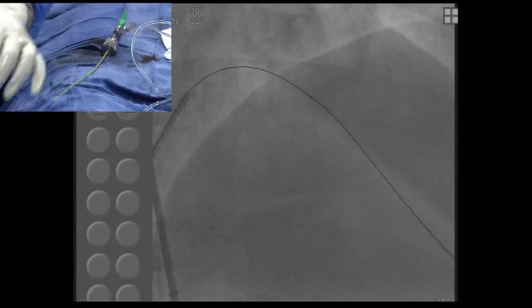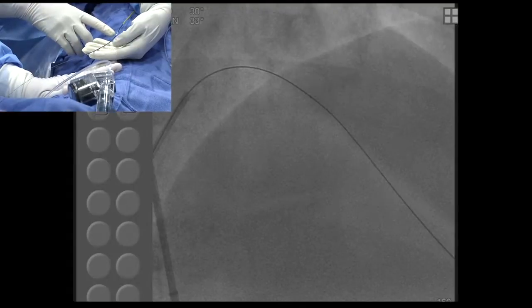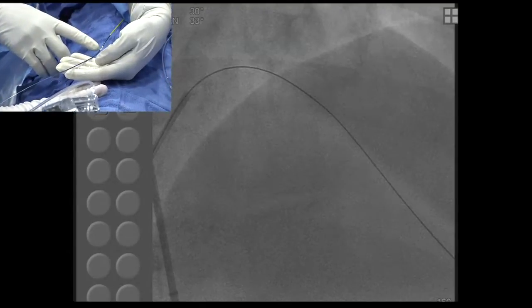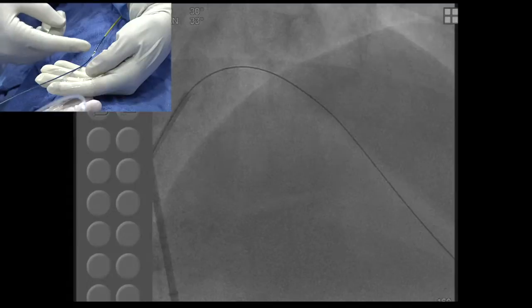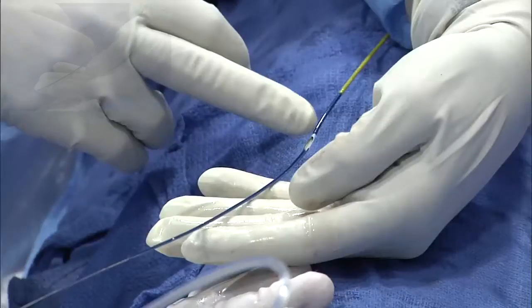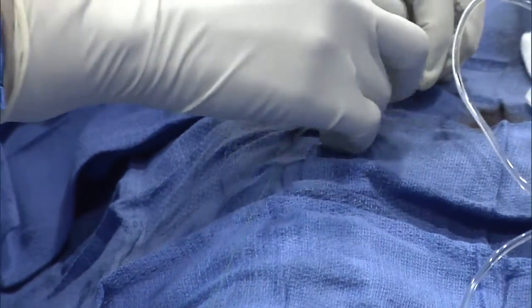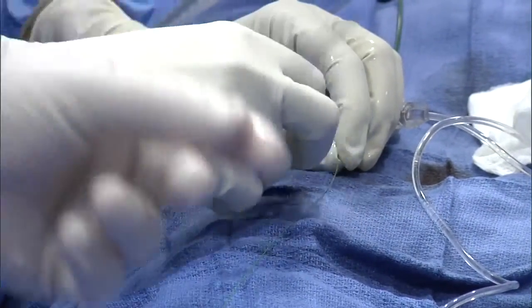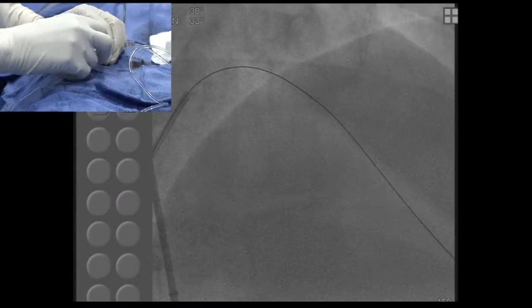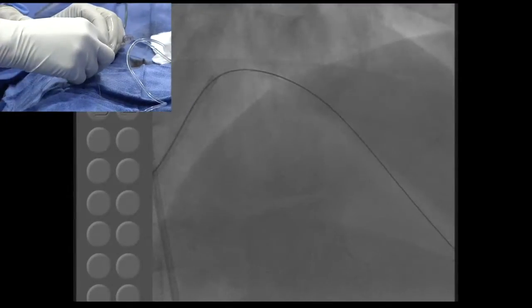Version of our Guideliner by Vascular Solutions, which is a very nice 25 centimeter. What has happened, they used to have at the entrance the metal, which used to be a problem because a stent used to get stripped. So now they have changed it. It's just a plastic extension all the way. And that to me is a major improvement they did. I can tell you that metal was a bad one. They used to have the plastic in V1, then in V2 they made metal, then V3 they went back to plastic, because a lot of money has been lost because of this change in their design.